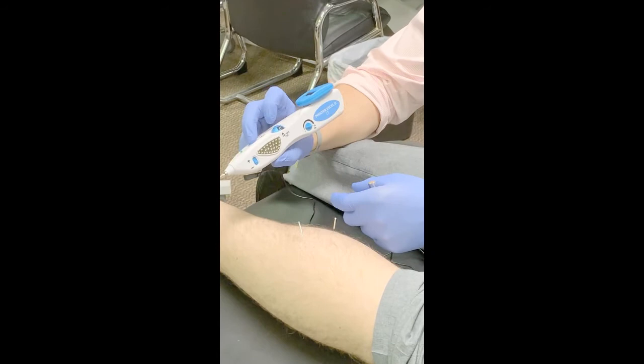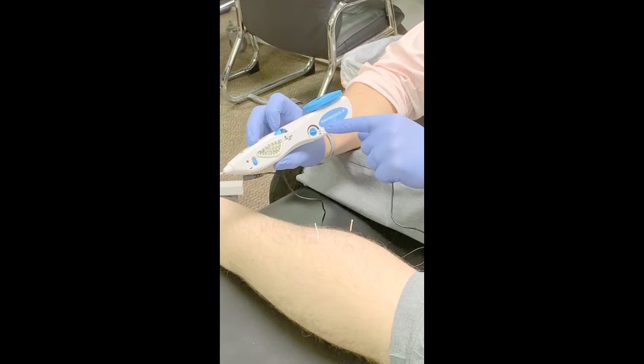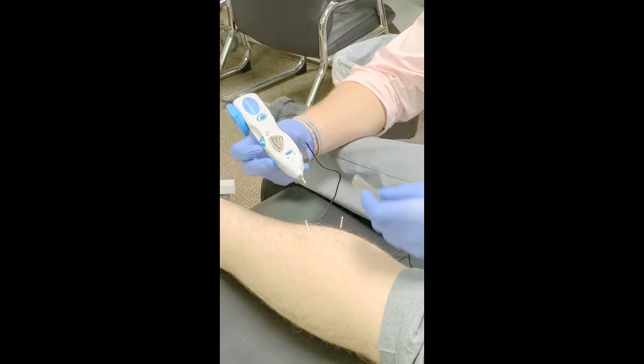We have to maintain depression of the trigger switch, and with our contact, we will slowly increase intensity. So we have our voltage, our trigger switch, the polarity switch, and lastly our frequency — our pulse rate in Hertz.